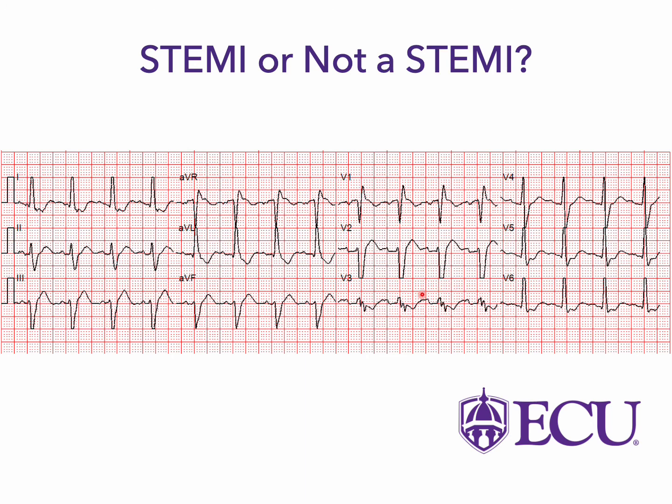So let's start. I like to start usually in the anterior leads. We have this widened QRS and we have ST elevation. But if we look at this, this is a negative QRS deflection with some appropriate ST elevation here. So this point is not more than 25% of this negative QRS complex. That does not meet Sgarbossa criteria. Over here we have our positive QRS complex, and we have some ST depression. But again, this depression compared to here is not more than 25% of that QRS complex. It does not meet Sgarbossa criteria to be considered a STEMI.